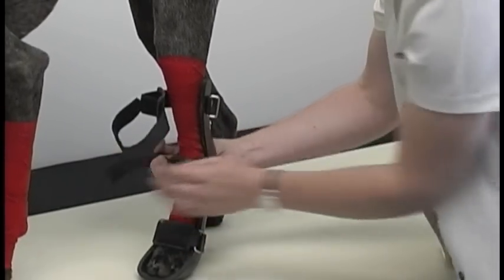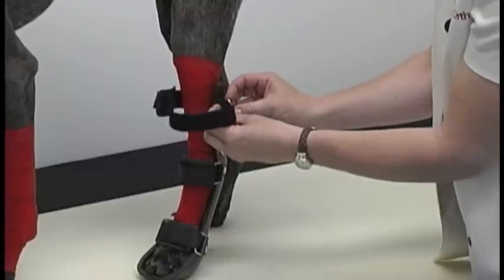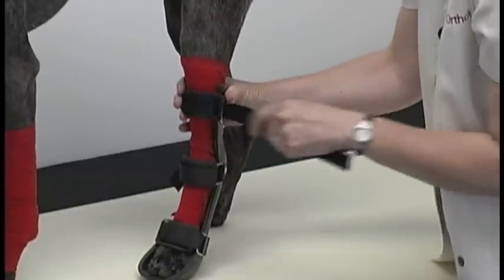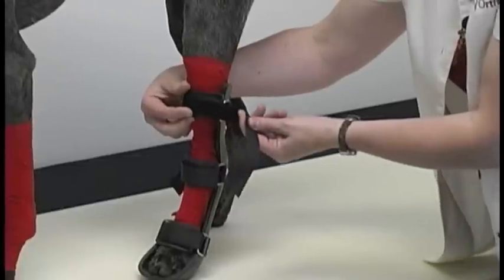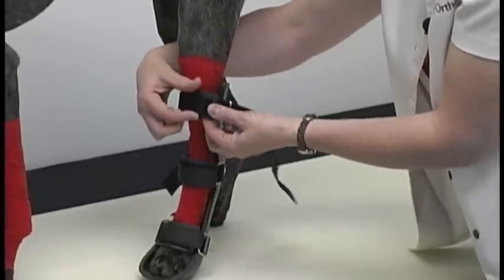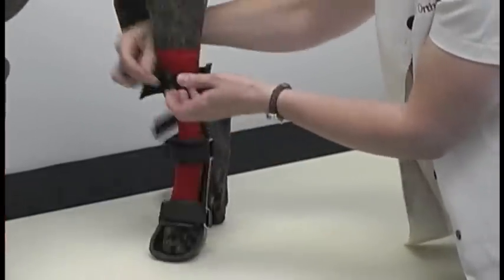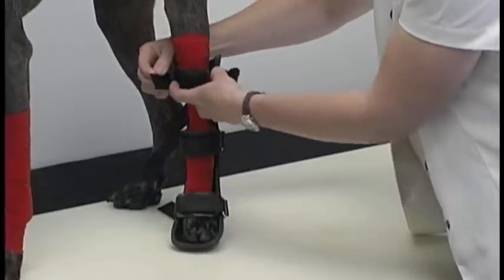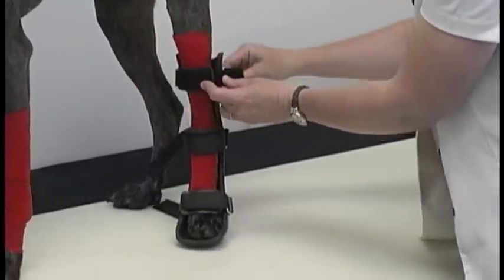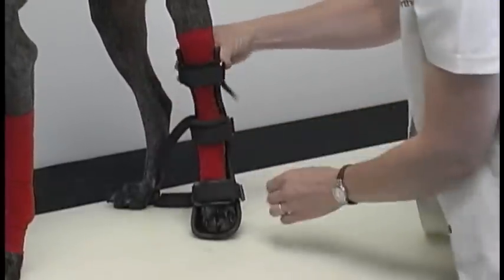Middle strap — snug it on there — and top strap. Nice and snug. Now I'm going to adjust the strap pad on this particular splint because it is in the way. I'll bring that around and adjust that — I just slid it over a little bit and we just tighten the strap down.